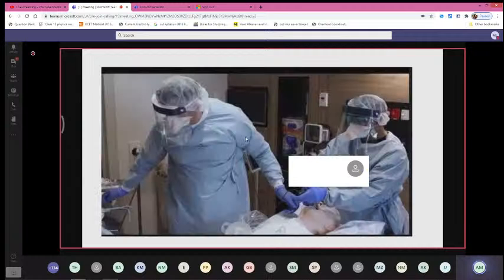So this is the intubation procedure which is being done, which you all should know. You can see both the performer and the assistant are wearing adequate personal protective equipment with gloves and face shield, because intubation is an aerosol generating procedure. If the patient is not adequately sedated, the patient coughs, then there's a lot of aerosol generation and it is going to infect a lot of staff. So adequate precautions are very much necessary.